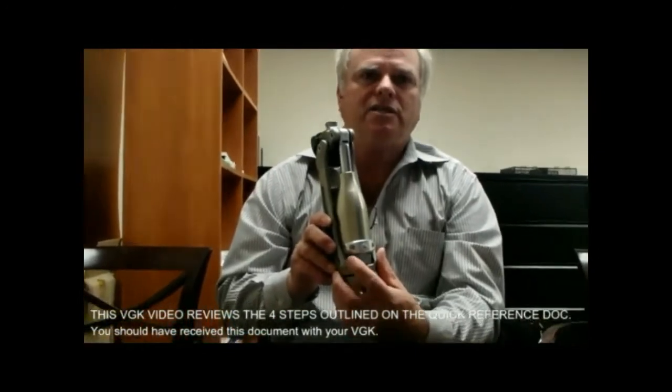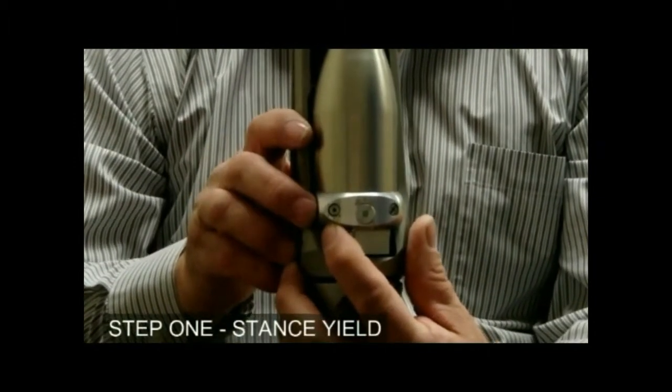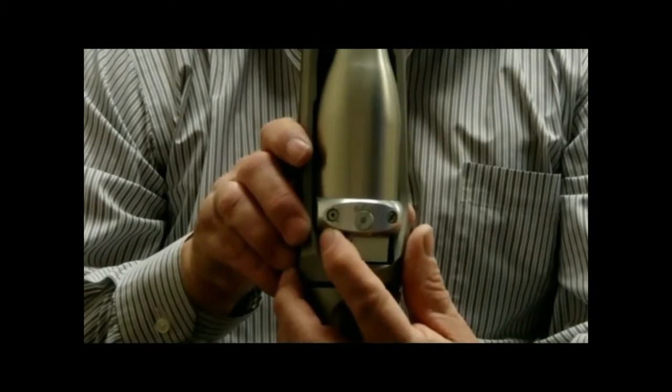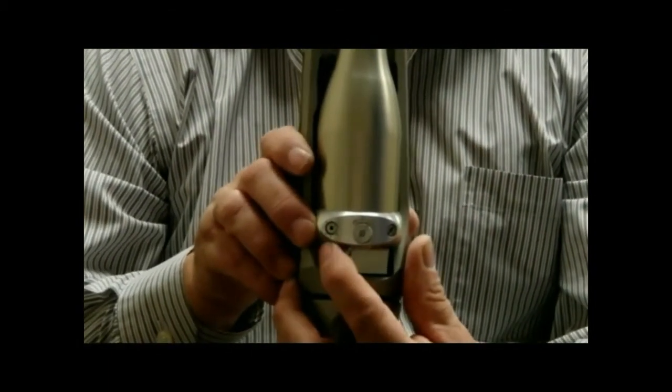First step is adjusting the stance yield. And the stance yield is the screw all the way to your left when you're looking at the back of the knee. That screw counterclockwise makes it yield faster, clockwise gives you more resistance. When you have the patient sit down, you want enough resistance that the knee helps them sit.